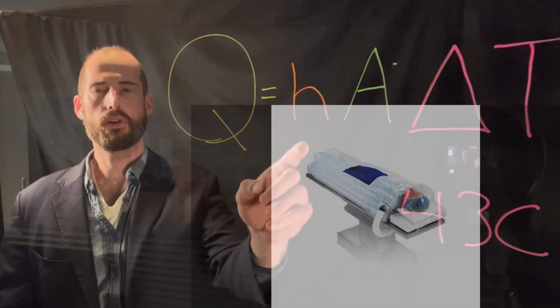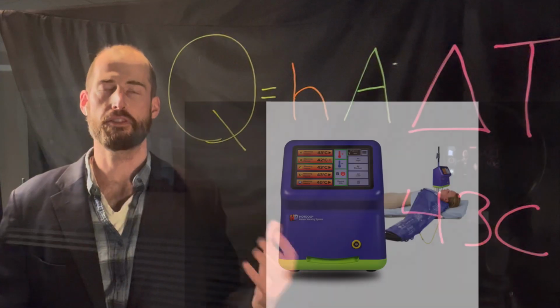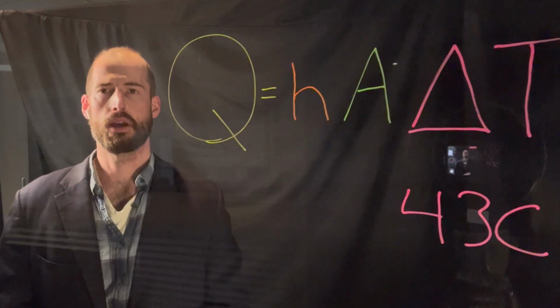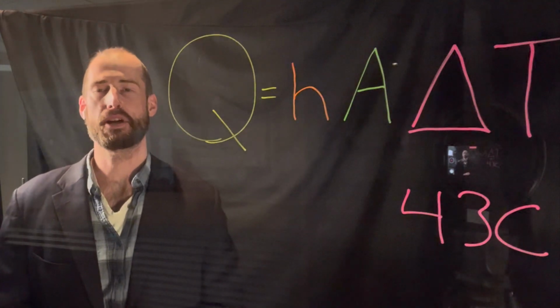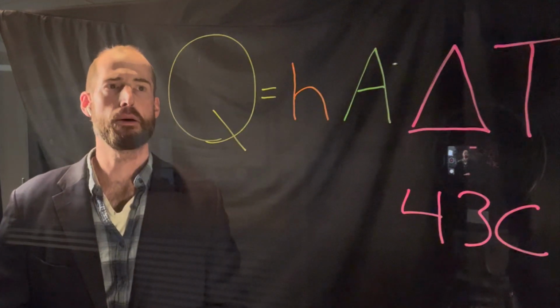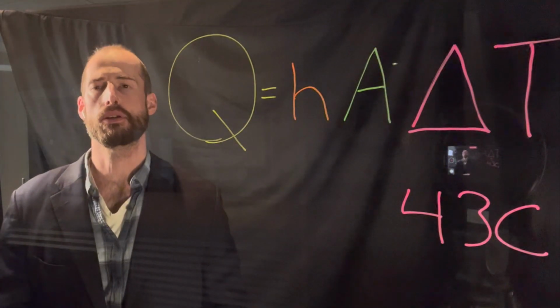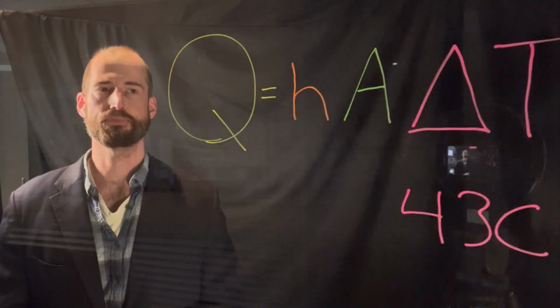So with both forced air systems that use blowing hot air and the conductive fabric system called hot dog patient warming, they have relatively low heat transfer coefficients. However, air is actually particularly poor at transferring heat, and therefore air systems have to pump some 1,000 watts of heat into the room in order to only have 50 of those watts actually get into the patient. But we'll talk about the waste heat problem in another video.